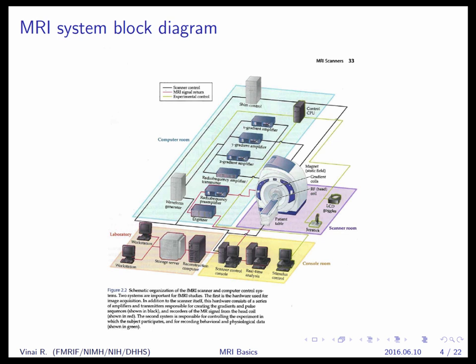It tends to be within RF, radio frequency, like FM radio and TV frequencies. A lot of this is around us, and it's really not harmful, especially at the energy levels that are used for imaging. And then at the end, after all the data is generated and digitized, there are computers that store and process the data, where the images are actually generated.